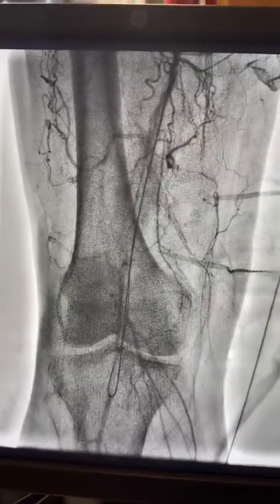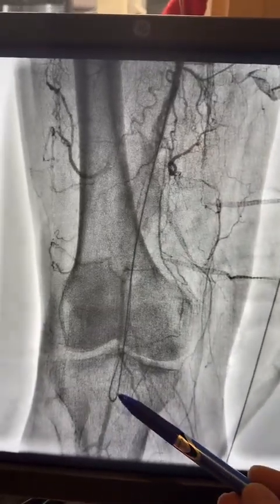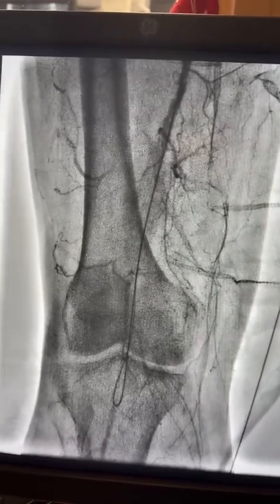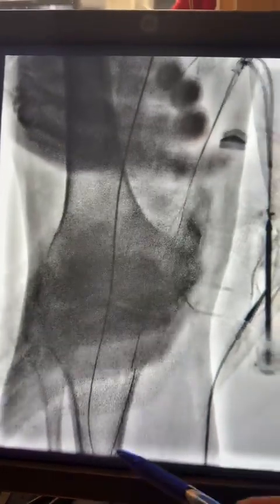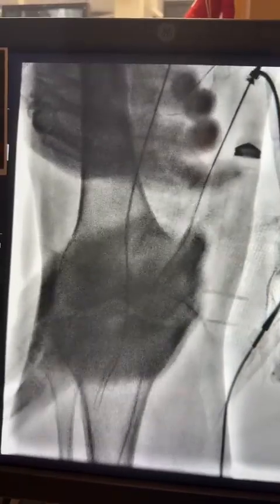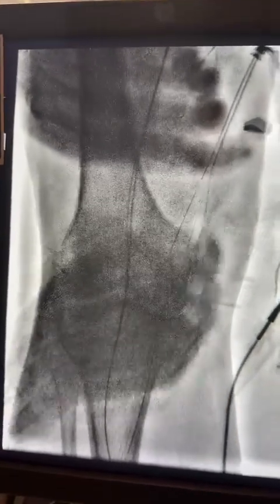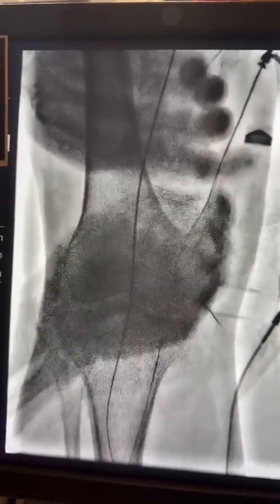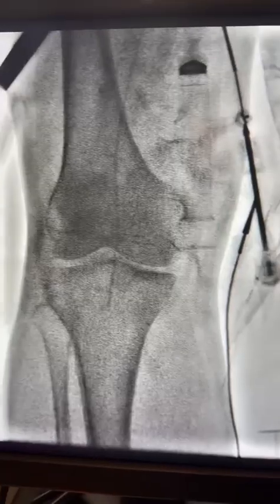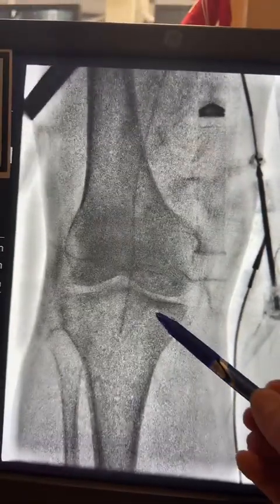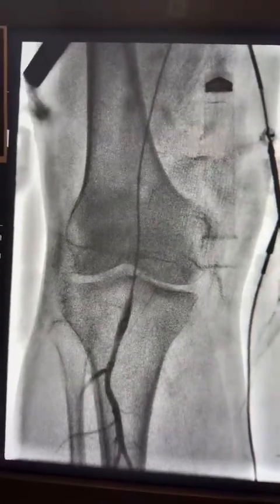Here you can see the wire went through the CTO segment and landed in the popliteal artery. I then advanced the glide catheter over it and exchanged the wire to a J-wire, which is safer distally.